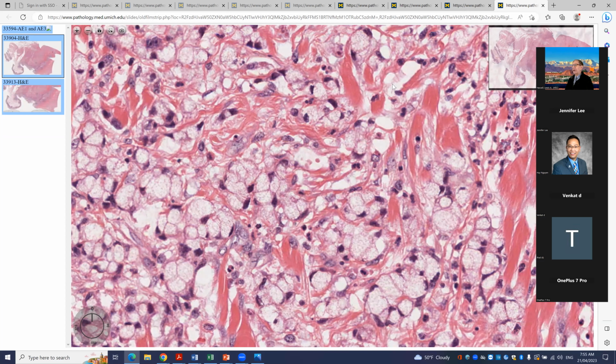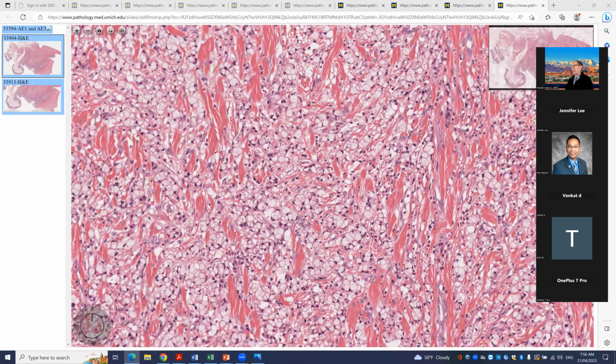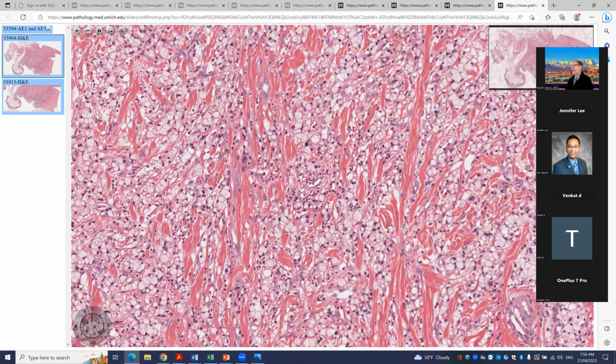Very good. Goblet cell adenocarcinoma. This is a lesion in this location that's relatively more frequent here than in other locations. And this is actually the reason why we're beginning to have a better understanding about these tumors, which have a combined neuroendocrine and non-neuroendocrine neoplasia.